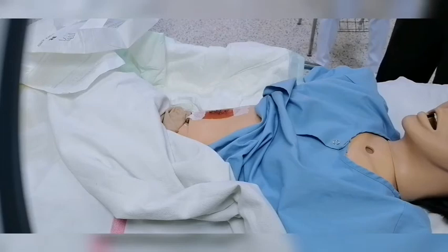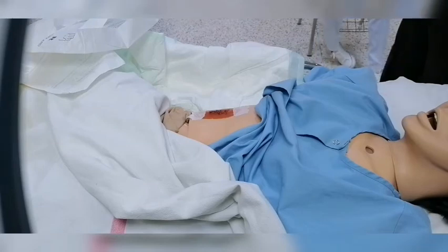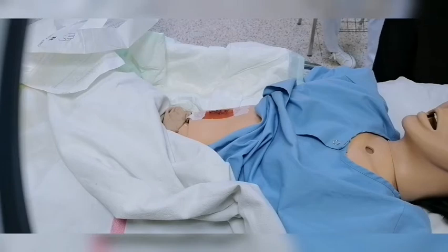After that, I can deal with the wound. I have to clean it. Depending upon the wound itself, I can use normal saline, and I can use betadine, hydrogen peroxide. It depends upon the wound itself. Here, if it is a clean wound, I can use just normal saline, or betadine and then clean it with normal saline.